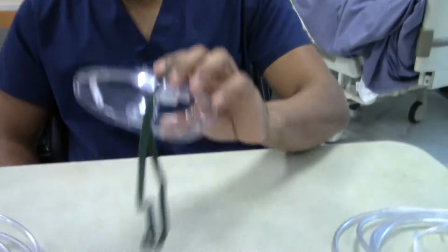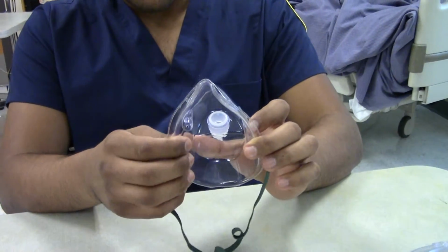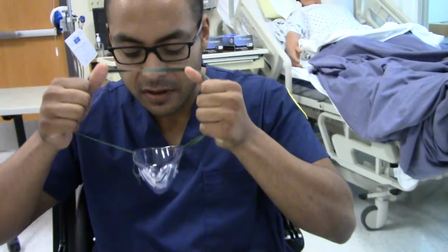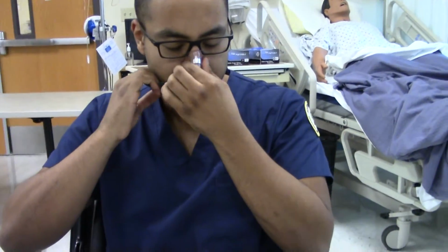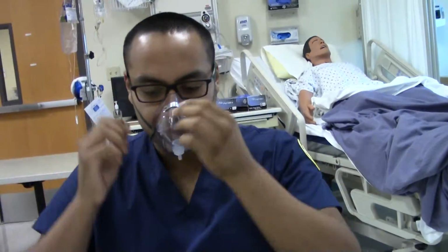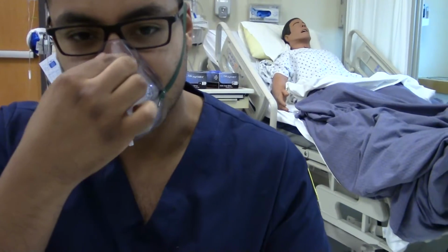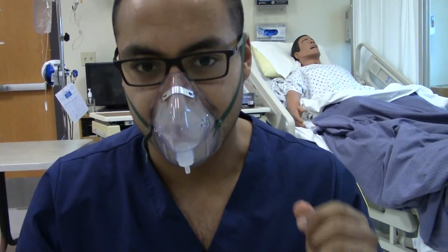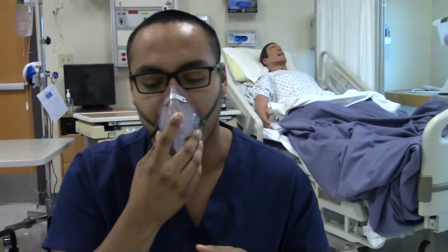Okay, and this is the simple mask. It has a FiO2 of 35 to 50% and a flow rate of 5 to 10. I'll put it on for the video. Nose flex. You see me flex my nose, you bend it. It has a middle thing for a reason. You bend it, make sure it fits the patient's nose. Connect, make sure the jaw isn't poking out, make sure the jaw's covered.